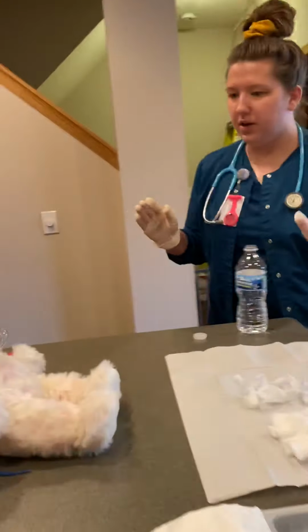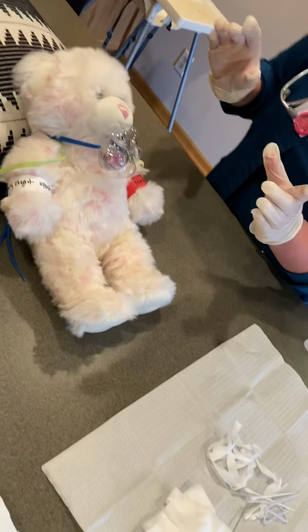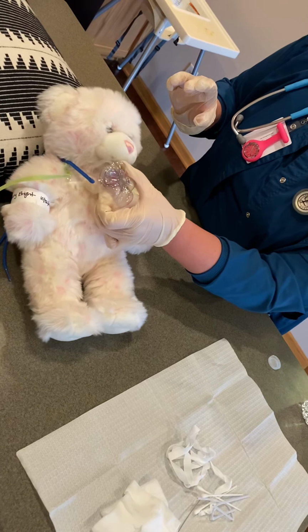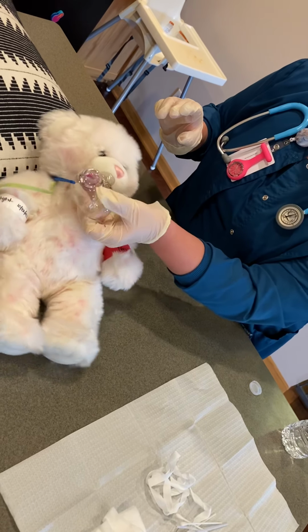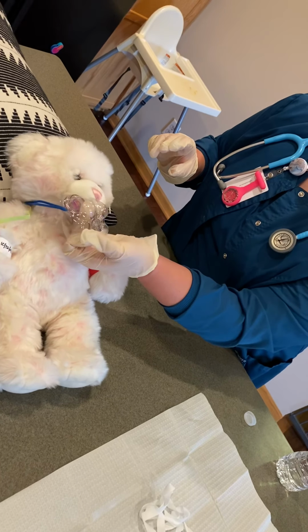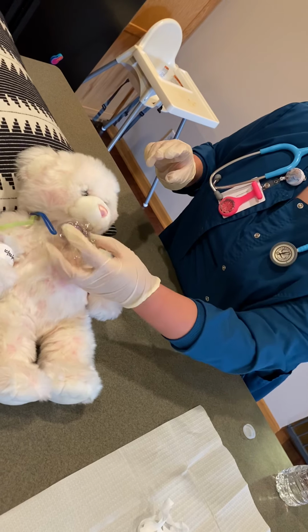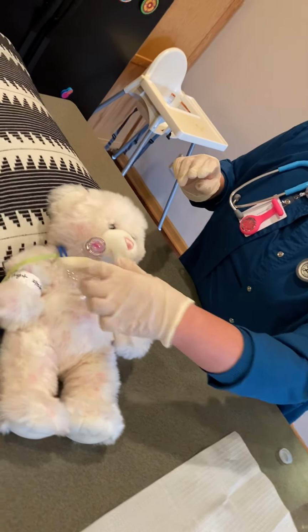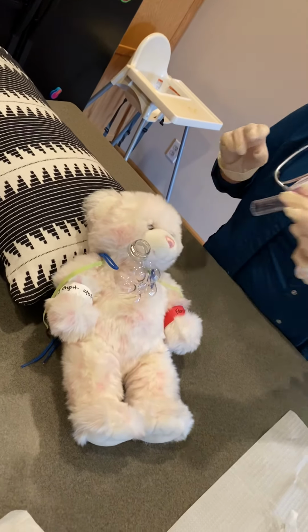and I'm gonna go around here, and I am going to take off the oxygen with my clean hand. Oh shoot. Bear with me, the setup, it's a little tight, so I'm just trying my best here. Okay, so, and I'm just gonna grab the top here.